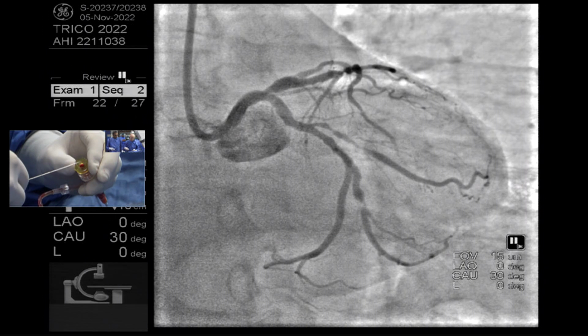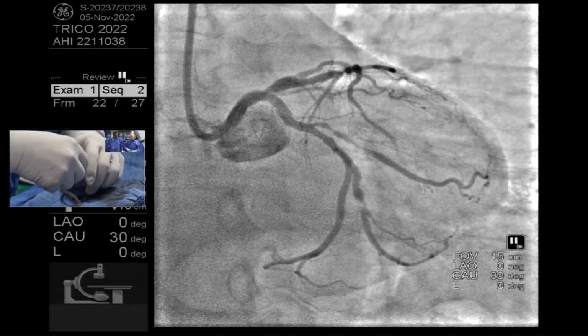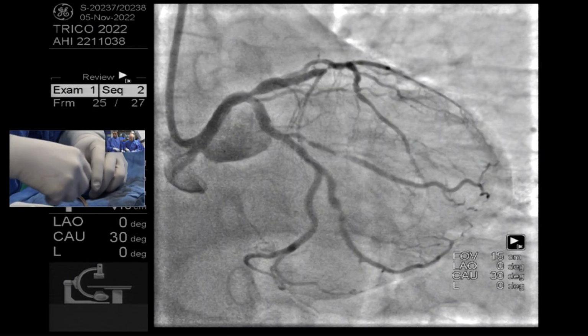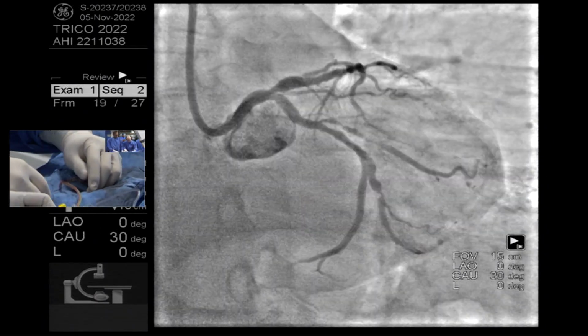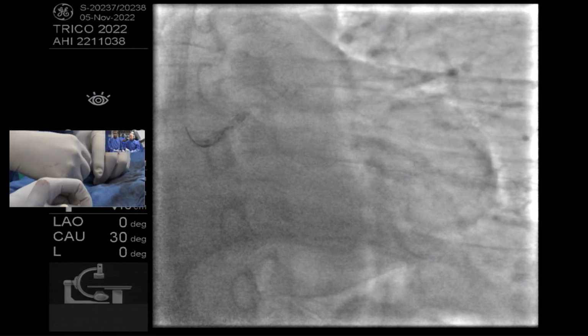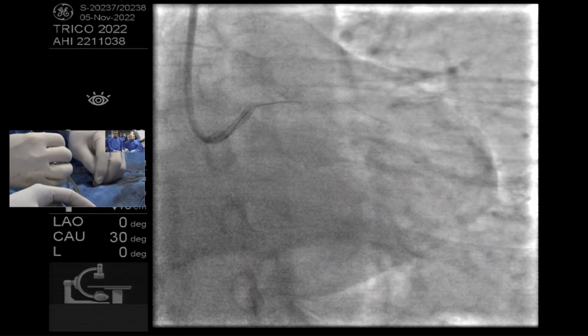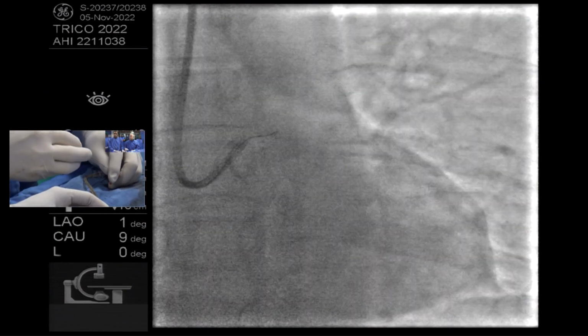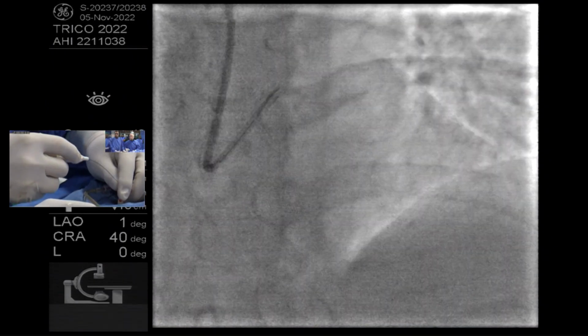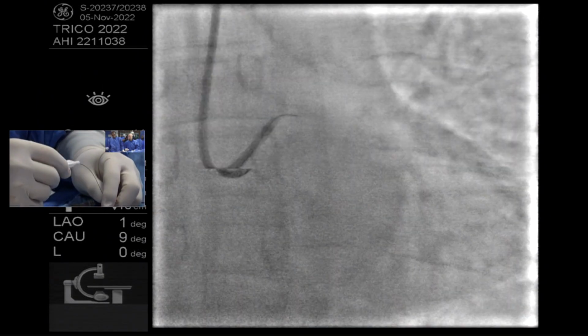First, I want to place this wire to the LAD.